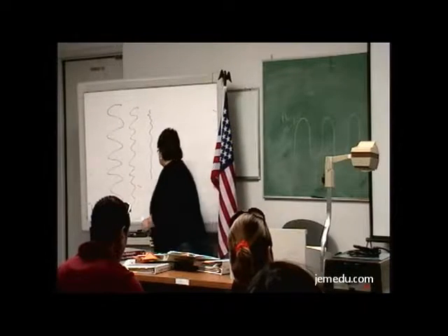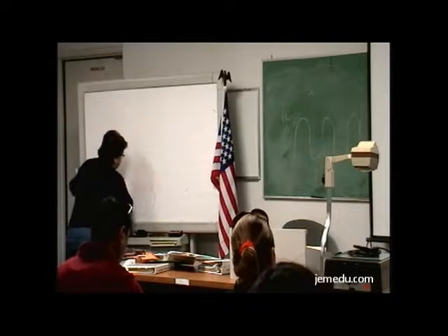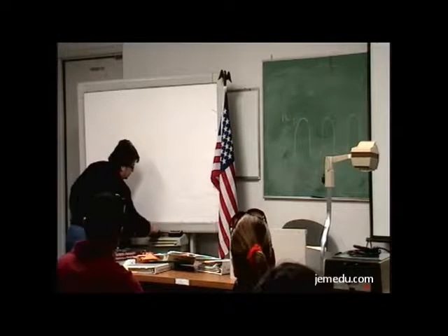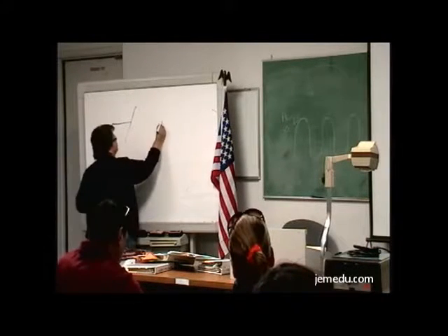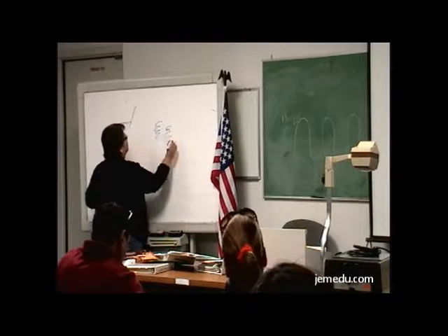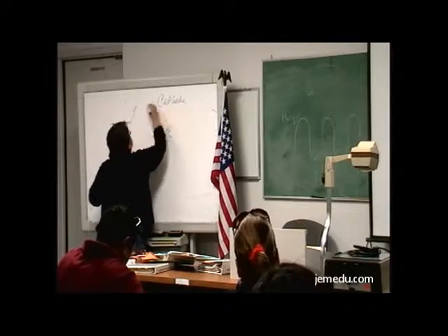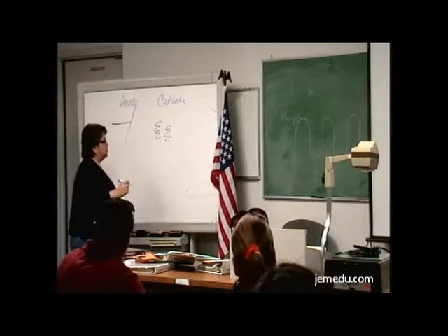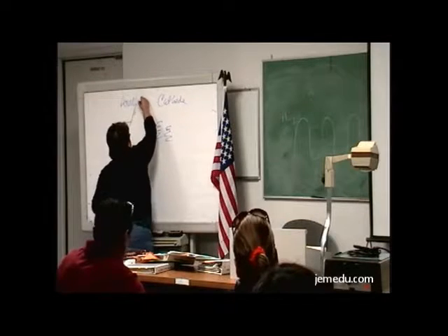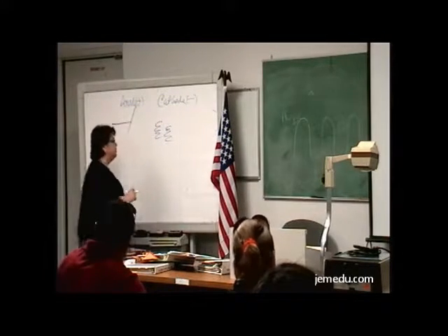All right. Let's get into that tube. It's been a while, maybe you recall the tube. We have two sides of a tube. What are they? Anode and cathode. Which is positively charged? And the negative? Cathode. Okay, what's on the cathode side?